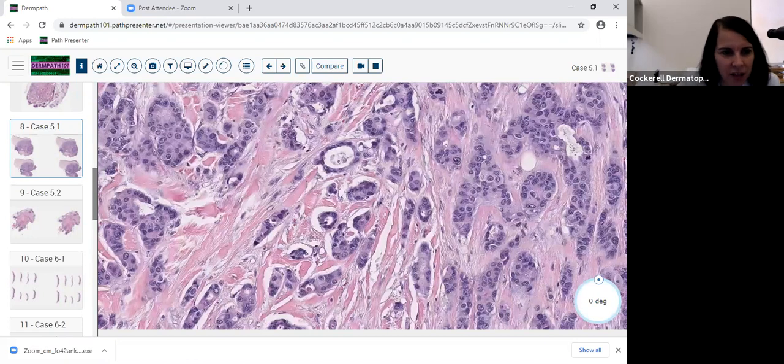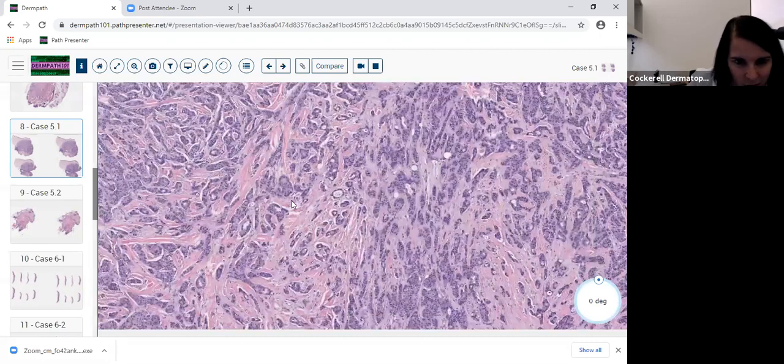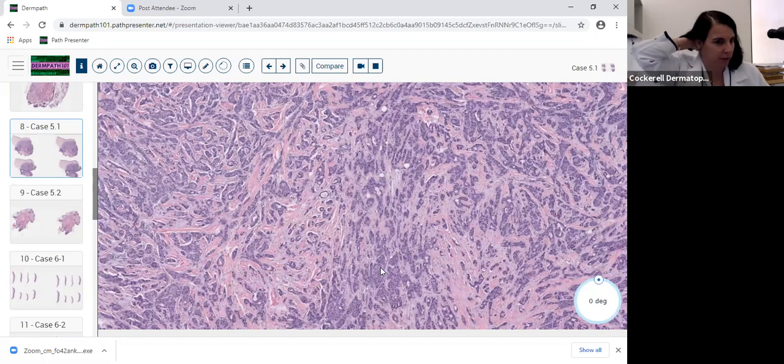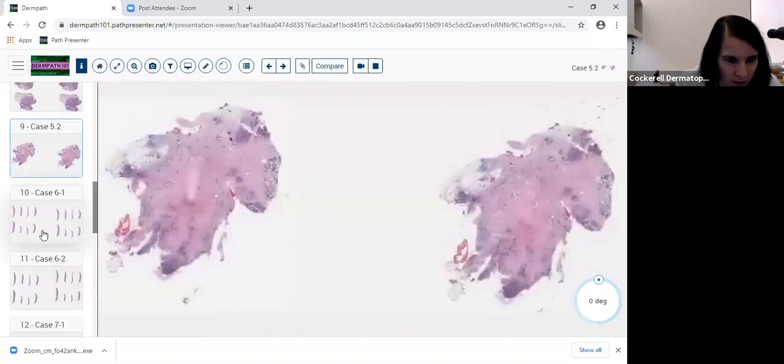So some of the things in the differential are metastatic lesions from the lung, from the breast, you know, from all over the body. And what we want to do is start to think about staining it. If you really think this is a primary skin adnexal adenocarcinoma, you can do stains for that as well. This was on the breast. I remember the location was breast and the patient had a history of breast cancer. And it has an appearance typical for breast. And I'll show you some areas where there are clues.